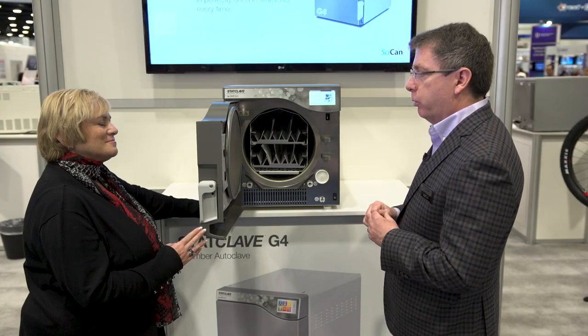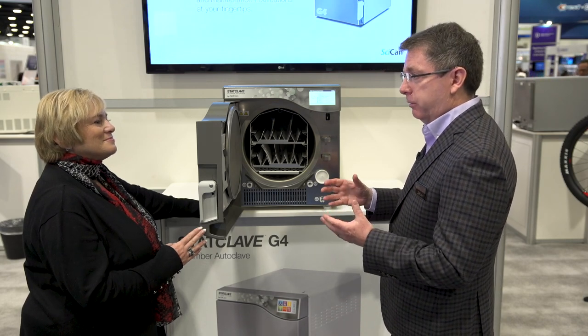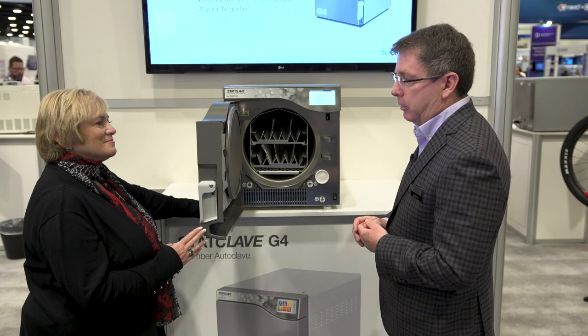The G4 technology also means that if anything were to go wrong, the machine would automatically email the factory so that we would know there was a problem, and it would automatically email the doctor's service technician of their choice. So everybody would be informed right away. It can also be set up to email the front desk so that the office knows there's a problem even before the staff in the back.